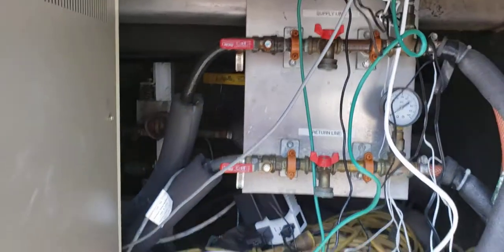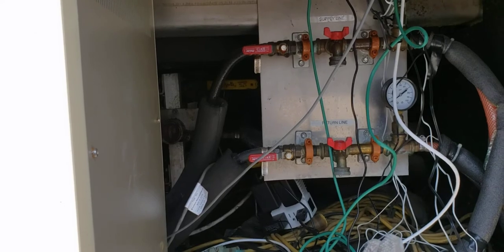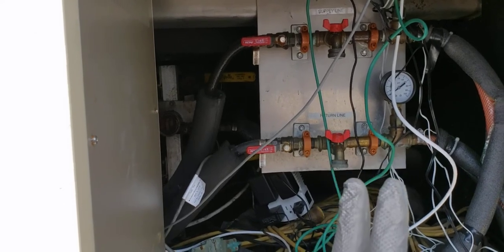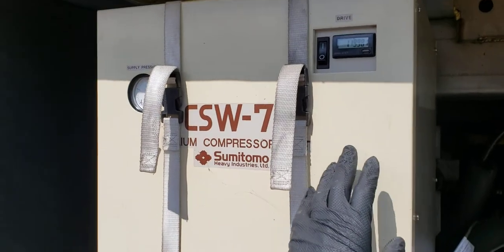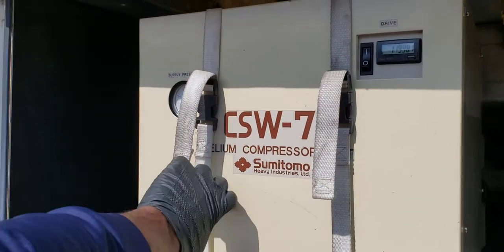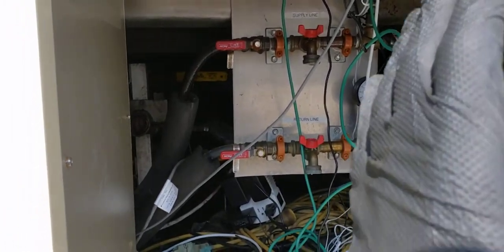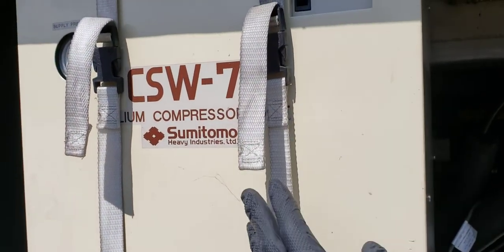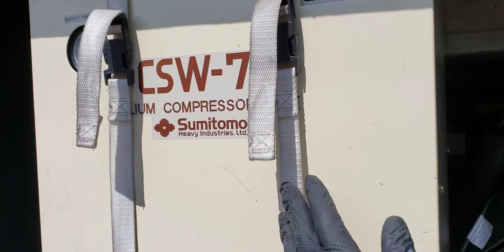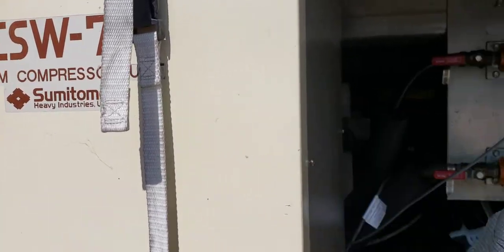Basically the chiller is cryogenic - cryo cooling. The chill water from the chiller cools down the condensing unit in this helium compressor unit. Once again, the chill water from the chiller cools down the condenser in this unit.